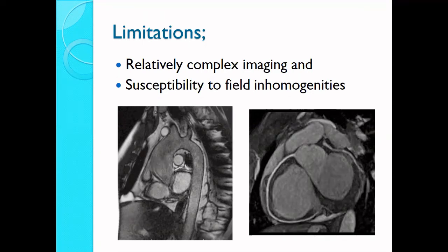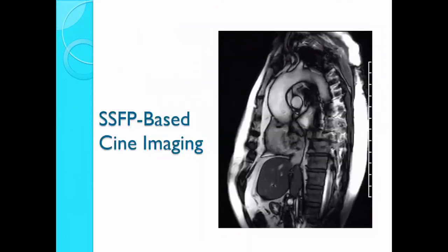like less invasiveness, and no radiation, because in a cardiac intervention procedure a very high amount of radiation is associated with it. So that's why we prefer a technique that is very efficient, having all of the other benefits that we are always considering in radiology. We call it the justification process. We always assess things based on risk versus benefit.